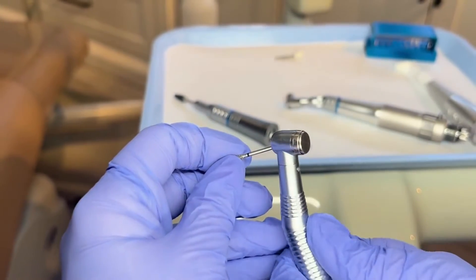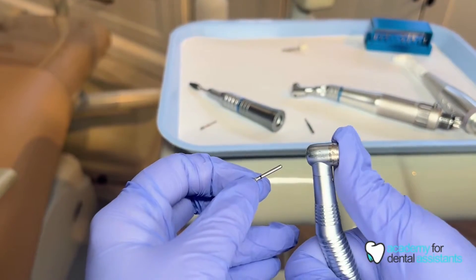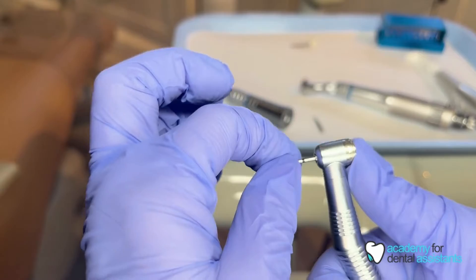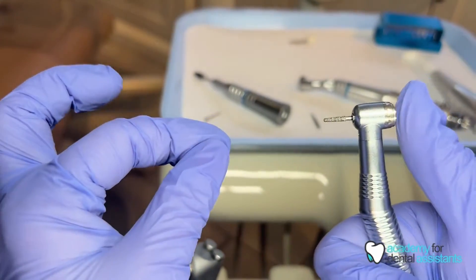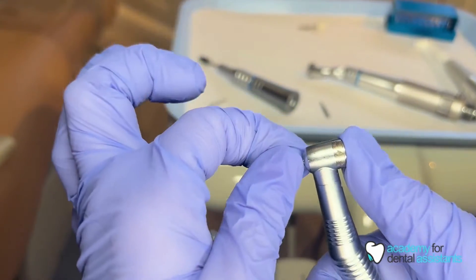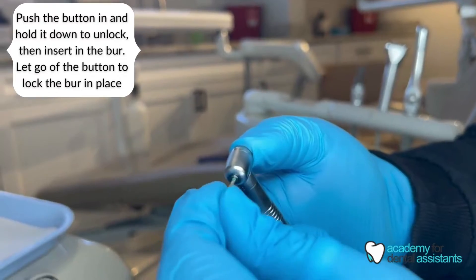To insert the burr, you're going to use a push-button high-speed. You push and hold in the button at the back to insert the burr, and give it a nice tug to be sure it's locked in place. Push the button in and hold it, insert the burr into the hole in the front, let go of the push button, and it's locked in place. Give it a nice tug to be sure.